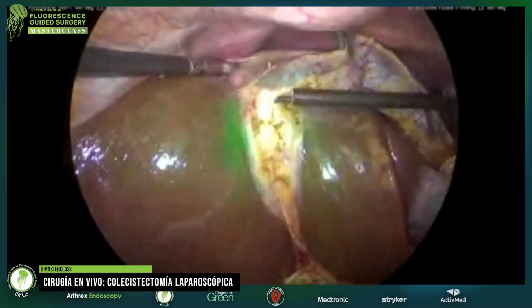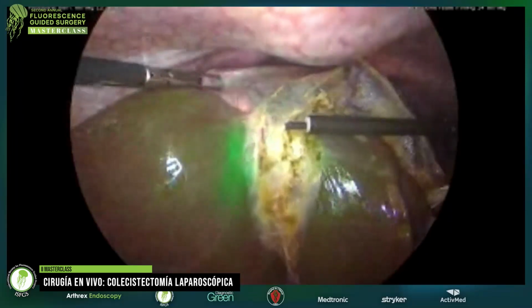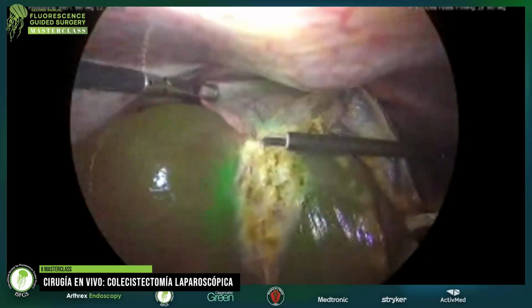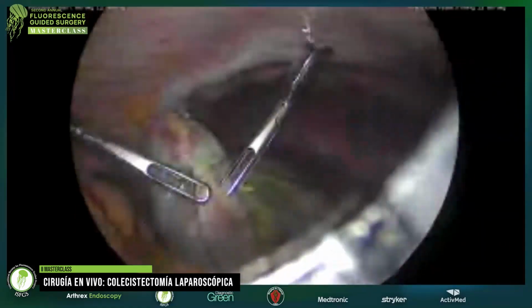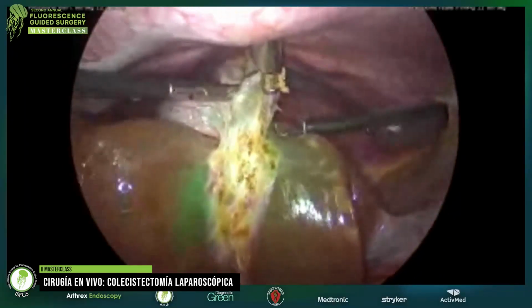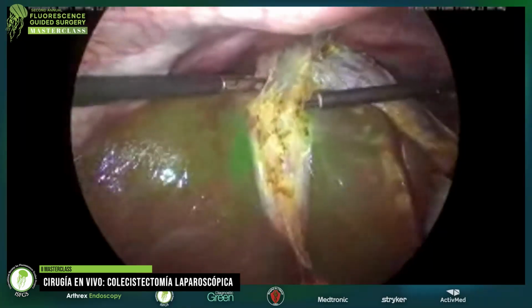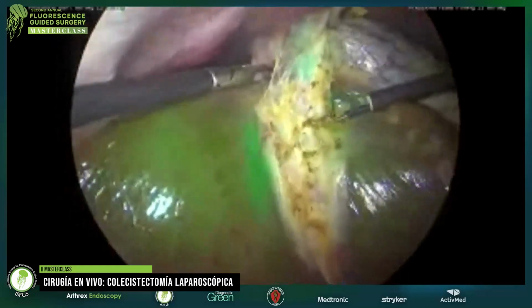We are a transplant center for liver surgery, and I can tell you that only us in that hospital, and there are 4 hospitals in my city that do transplant surgery, we do between 3 and 4 cases of liver transplantation every year for common bile duct lesion during laparoscopic cholecystectomy. So I think that with the image you saw today and the surgery that Ludovica did, it's almost impossible to make a major lesion to the common bile duct if you have this kind of visualization. So there is a need for increasing the adoption of fluorescence cholangiography, even in Italy, a country that, together with the United States, is one of the countries where fluorescence uptake is the highest. Definitely probably the highest in Europe.